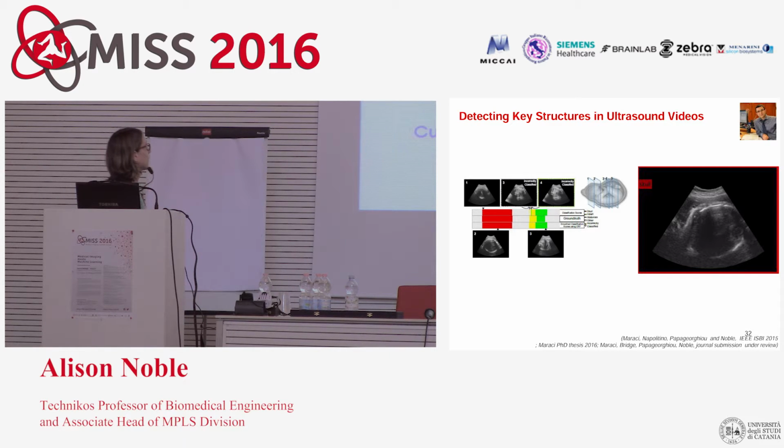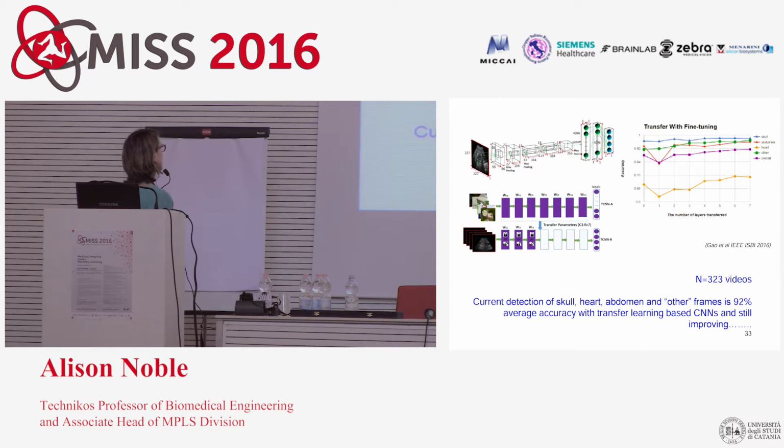And some of our most recent work, just to show that I also work with CNNs, and most of my lab now works with CNNs, was published this year. I won't go into the architecture, but it was a transfer-based method, and using about 323 videos of our current database, you can get a detection rate of about 92%.